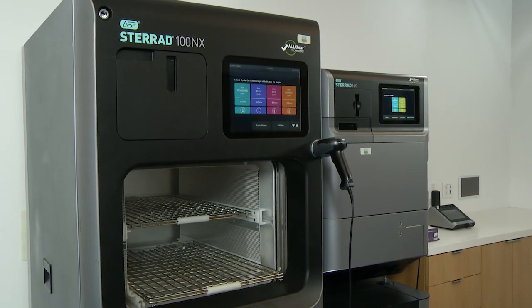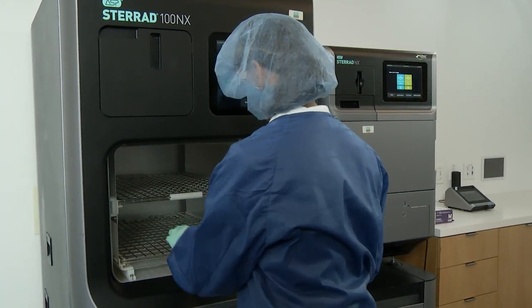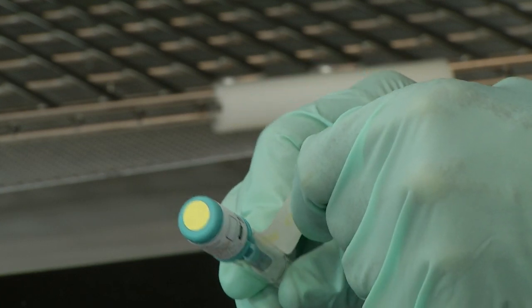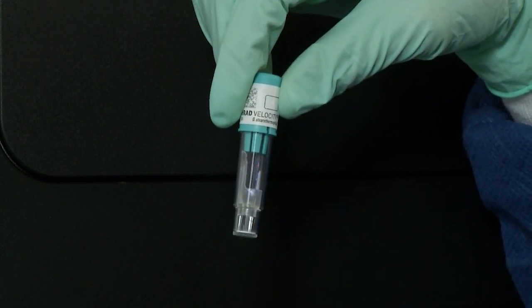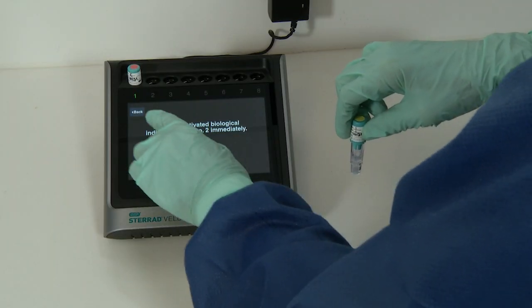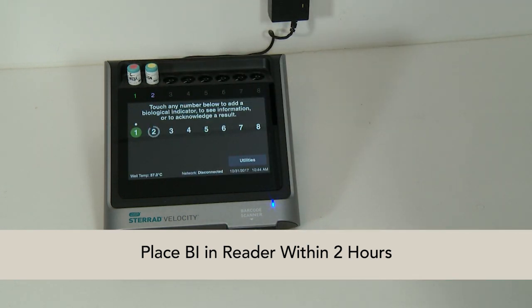After the cycle is completed, put on protective gloves and remove the biological indicator from the sterilizer. Check the chemical indicator on the top of the BI to ensure the color changed from red-pink to yellow. Then remove any tape from the growth reservoir prior to placing the BI in the reader, as tape will obstruct the fluorescence detection, causing misleading results. Inspect the BI to ensure that the growth medium is purple, the ampoule remained intact during the sterilization cycle, and the spore disk is lying horizontally on the bottom of the growth reservoir. Be aware that the BI must be placed in the reader within two hours of completing the sterilization cycle.